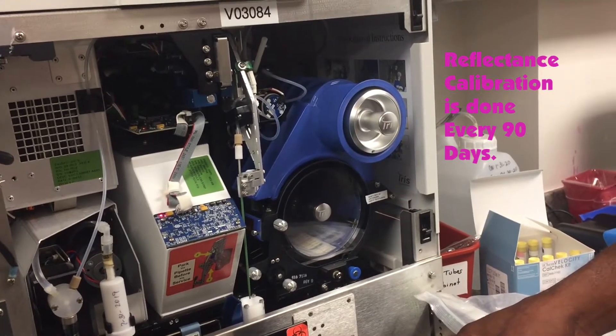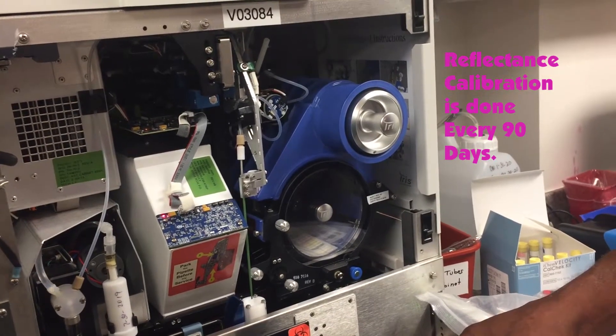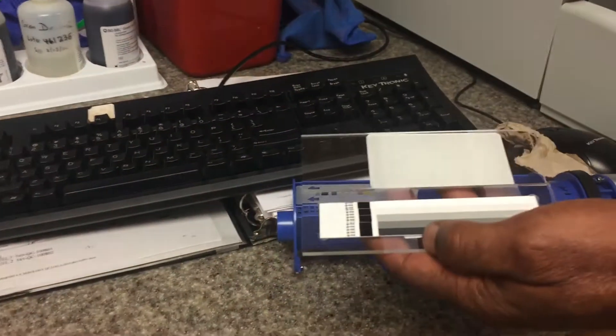How often should you do it? The customer does it every 90 days. Put on the kit. I'm going to take out the strip loader.